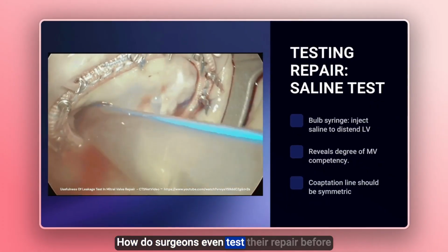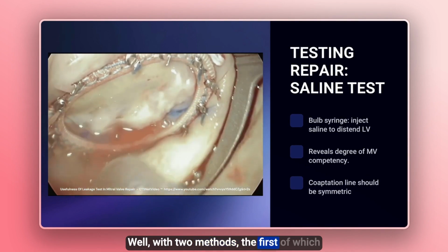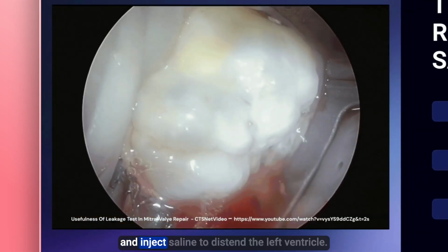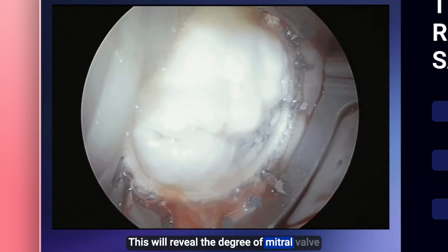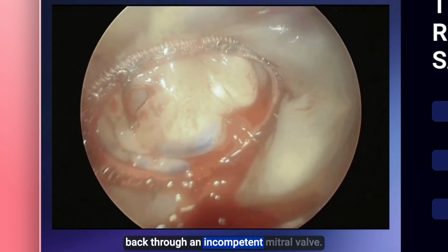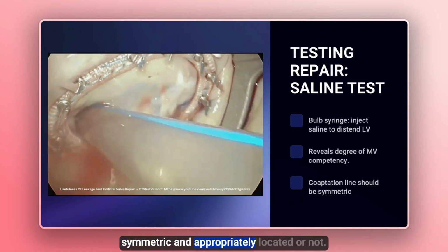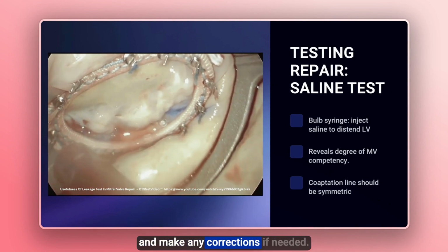How do surgeons even test their repair before they come off cardiopulmonary bypass? Well, with two methods, the first of which is the saline test. They take a bulb syringe and inject saline to distend the left ventricle. This will reveal the degree of mitral valve competency if you see that fluid coming back through an incompetent mitral valve. It can also show you if the coaptation line is symmetric and appropriately located or not. This allows them to evaluate repair quality and make any corrections if needed.